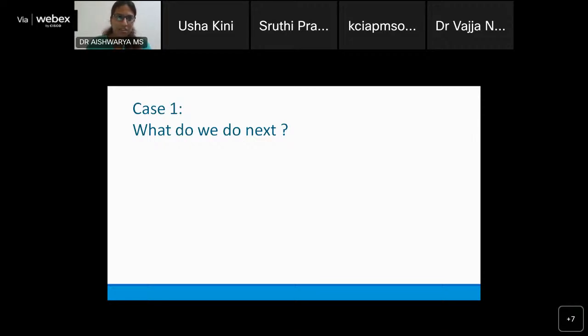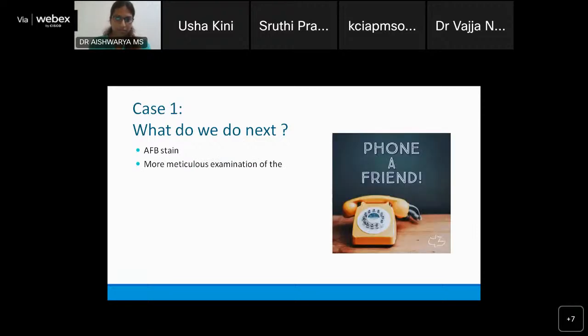TB and leprosy I would like to rule out as a hard and fast rule, given that we are in India. In leprosy, with this kind of morphology, the cytoplasm of those epithelioid cells will be vacuolated. It could be tuberculoid type, right? Yes, ma'am, but then the way it would present in a lymph node would be different. I can tell you ZN was done on the slide, and it was negative. More meticulous examination of the patient is required.